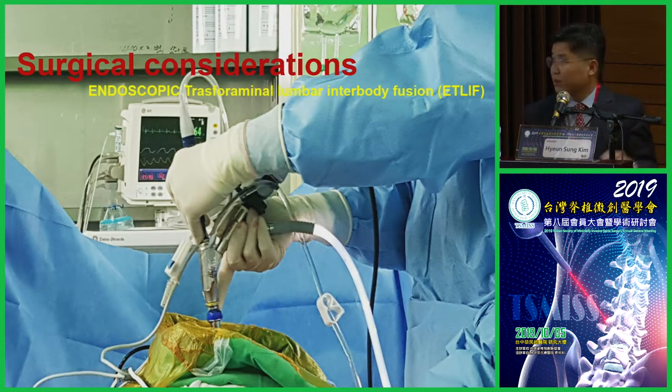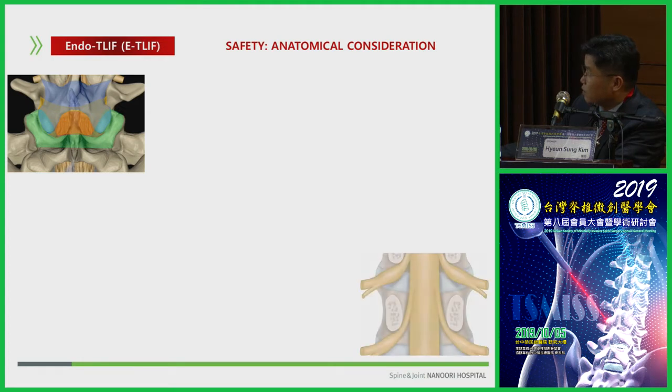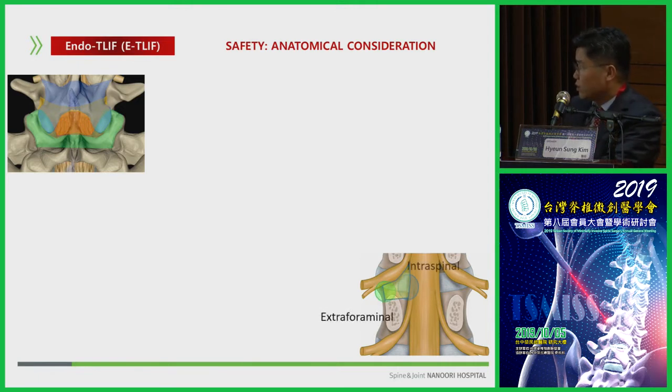Nowadays, first we check that fusion surgery can be divided into the anterior approach and posterior approach, but in endoscopic fusion surgery we still perform the posterior approach. First we check the surgical considerations. We already know that we resect the inferior articular process and some part of the superior articular process, and then insert the cage through there. But nowadays we have introduced three kinds of endoscopic posterior fusion surgery technique: one is extraforaminal, one is transforaminal, and one is intraspinal.